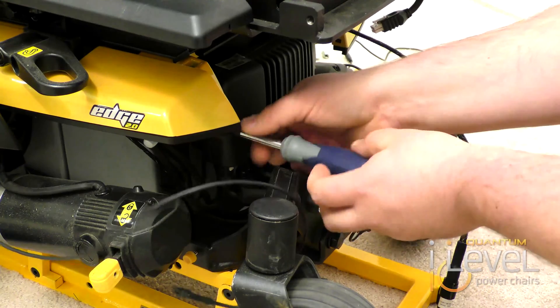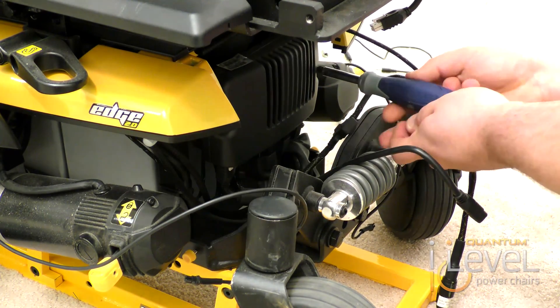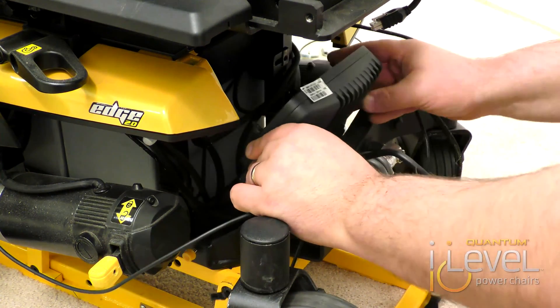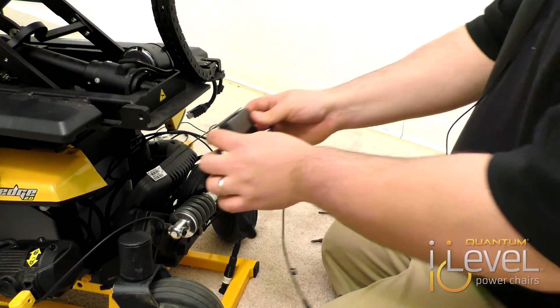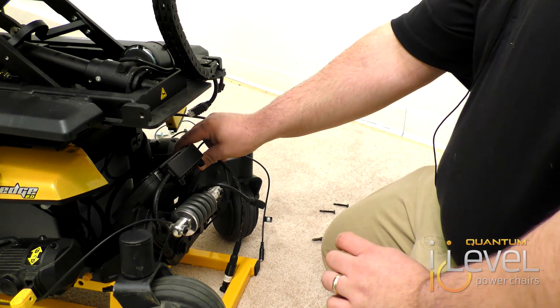Take your Phillips head screwdriver and you're going to remove the power module from the base. Once that's actually removed, put the screws off to the side. This is the switch operator module. Basically what it's going to do is slip over the screws and attach right above the power module in the base.